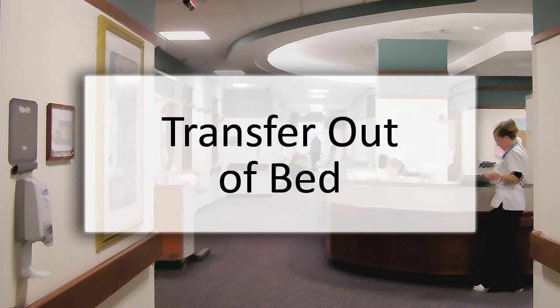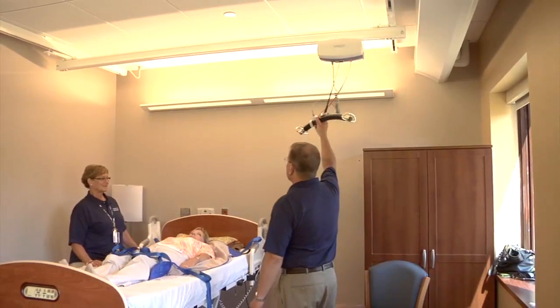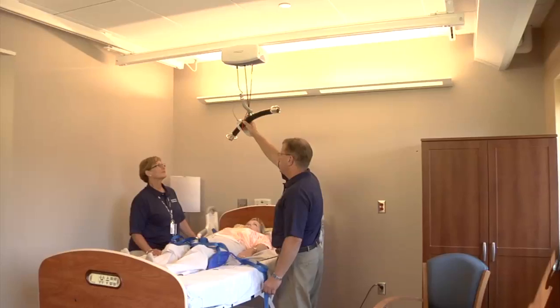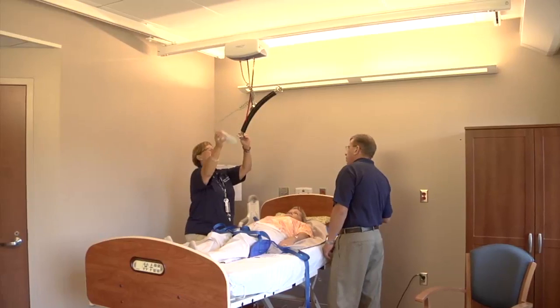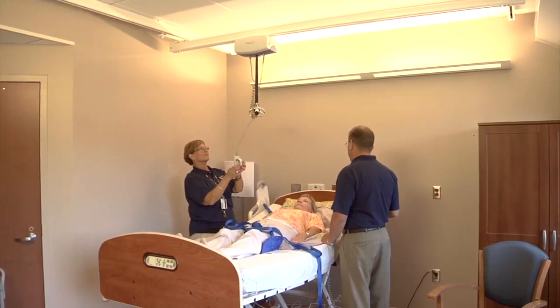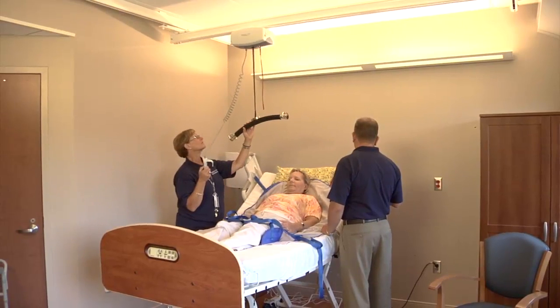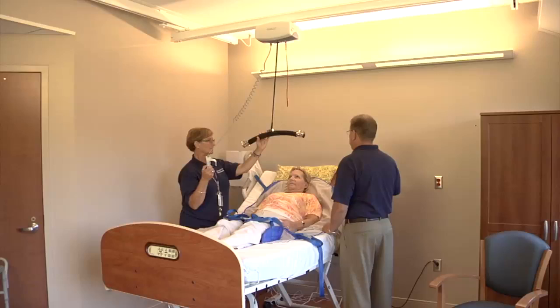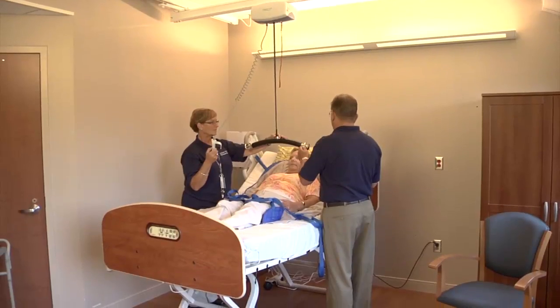In this clip, we're going to take a look at a transfer out of bed using a ceiling lift. The patient is on a split leg hammock sling. The ceiling lift is brought in and the patient is attached. Some of the most important things to remember when you're doing a transfer out of bed is that you want to use the bed to your advantage. You don't want to lift the patient to the carry bar. You want the patient to be close to the carry bar by elevating the head of the bed.